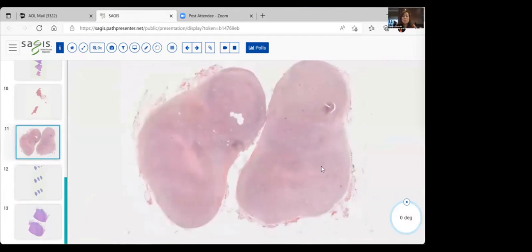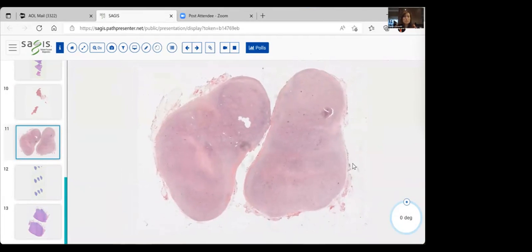All right, I love this tumor too. As you can see, this is a tumor that has a well-defined, well-circumscribed collection of cells. Now, I have to say that this has been shelled out, so you can't tell necessarily where it came from, but this typically occurs on the hands, particularly the dorsal aspects of the fingers.